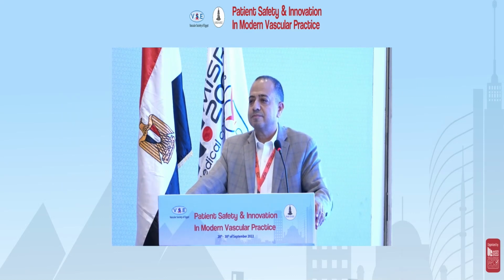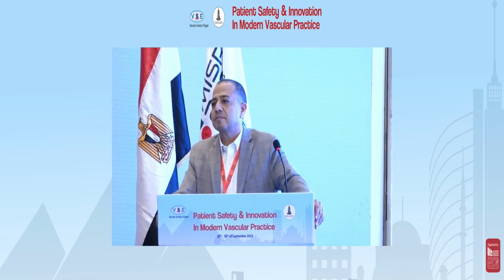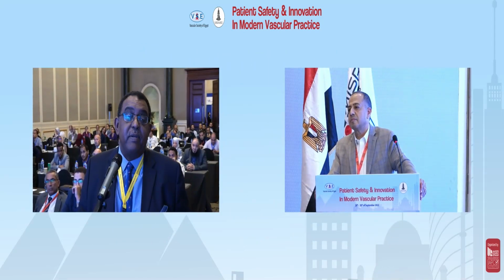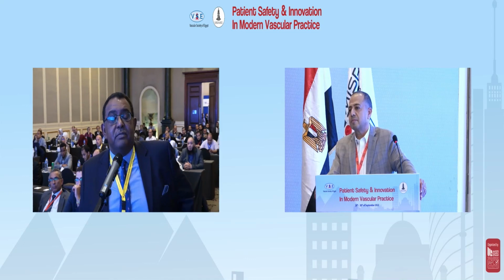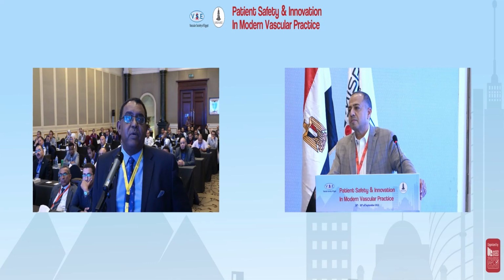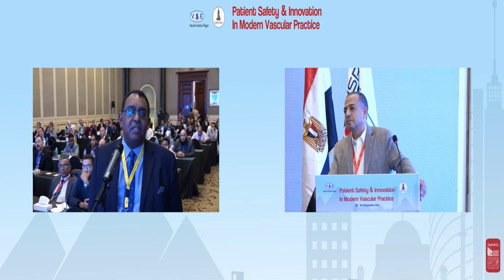Yeah, can I just follow on to that? I do understand that in May-Thurner and venous disease, IVUS is a nice extra tool, and everybody says you have to use it. We don't use it. We do a lot of iliofemoral DVTs and May-Thurners, and by and large we get away without jailing any of the right iliac. I'm not sure that jailing is such a big deal, really. People say it is, but if you're using an open cell stent, it's not a big deal.